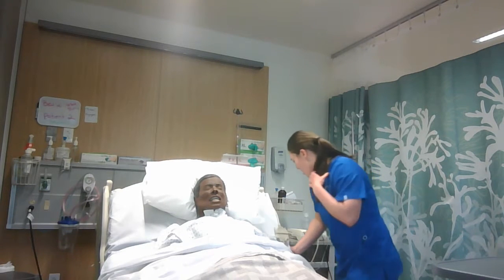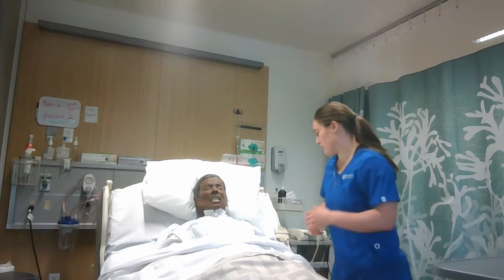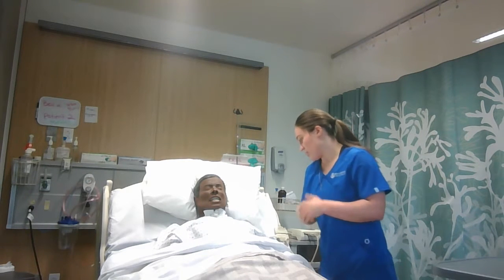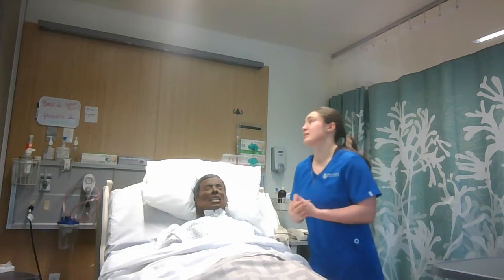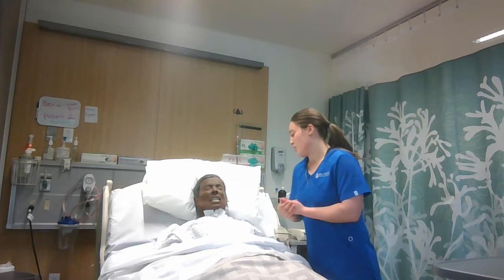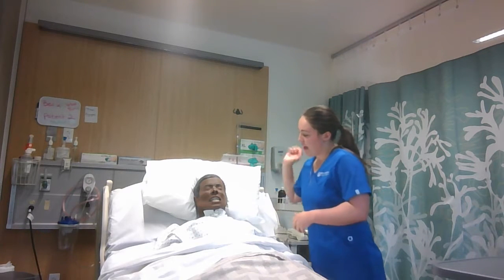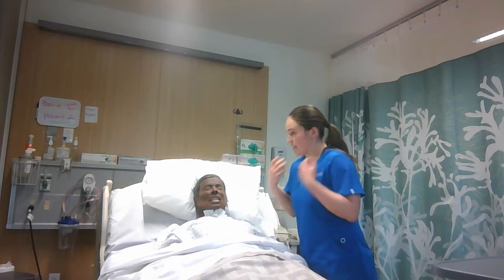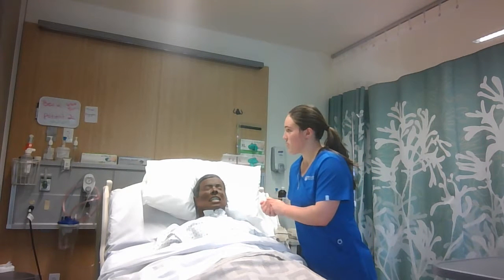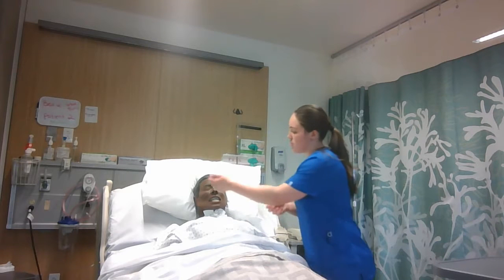All right. They're in high Fowler's position, and then I'm going to explain to them what I'm going to be doing. Because this is going to be a drug without a spacer, I'm going to tell them that I'm going to shake it first, and then I'm going to have them exhale all their air out, and I'm going to put the mouthpiece near their mouth.